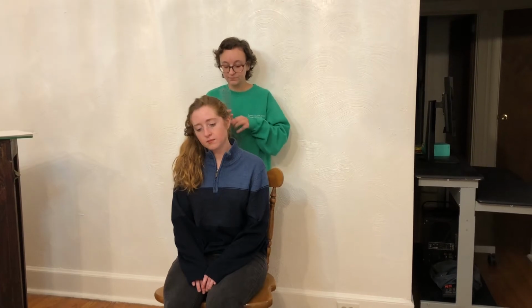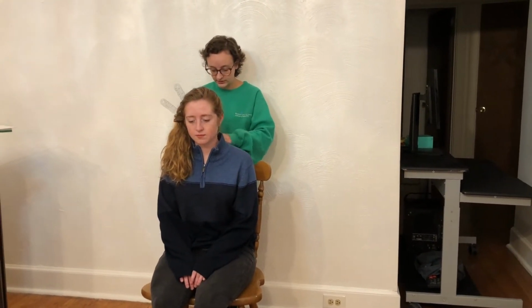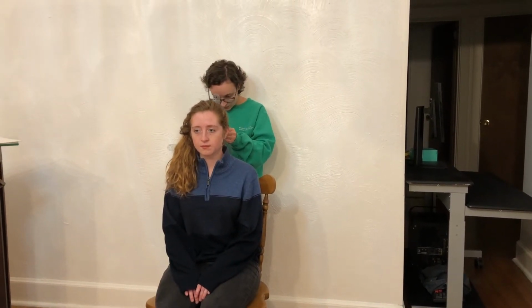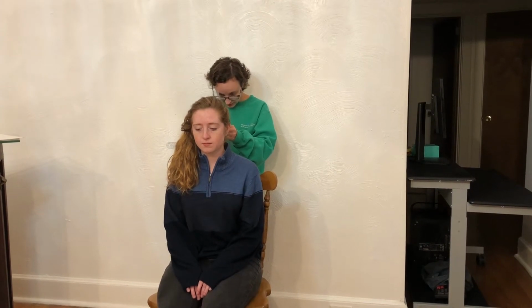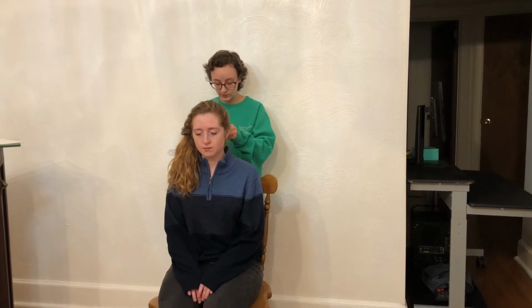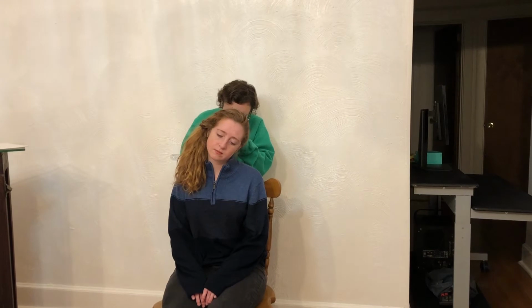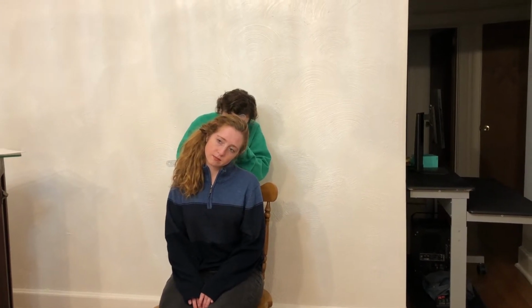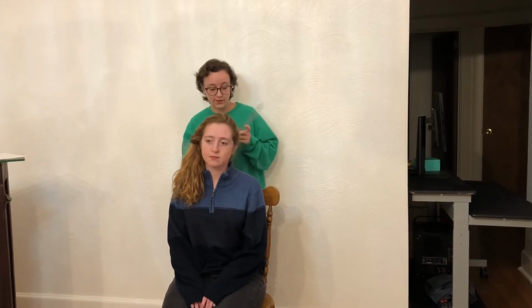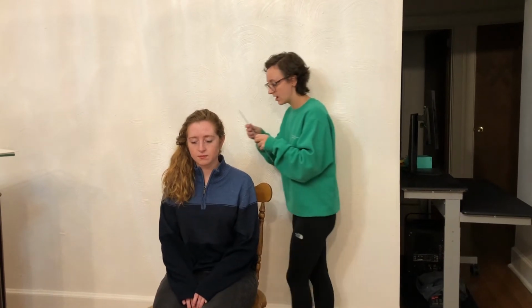Fantastic. Okay. Now I'm going to go ahead and do the same on the left side. So find her C7 again. Stationary arm out to the side. I'm going to start at a 90-degree angle, but technically starting at 0. So what I want you to do is go ahead and bring your left ear to your left shoulder. And 45 degrees. Great. So again, that was cervical lateral flexion on both sides.